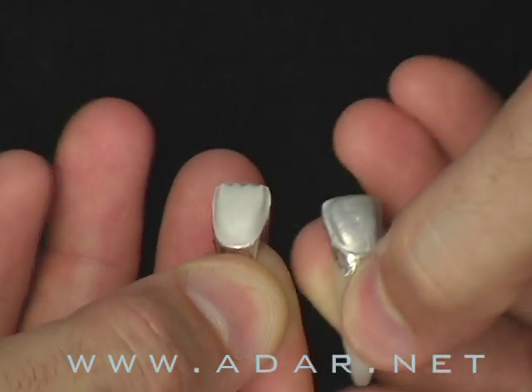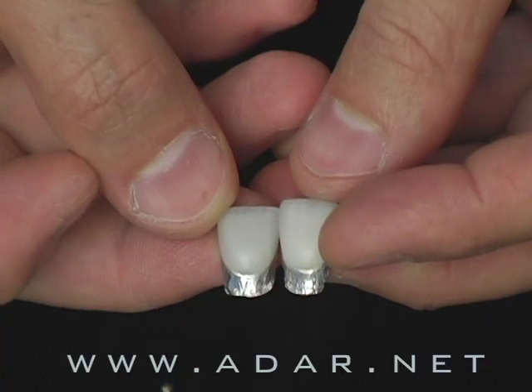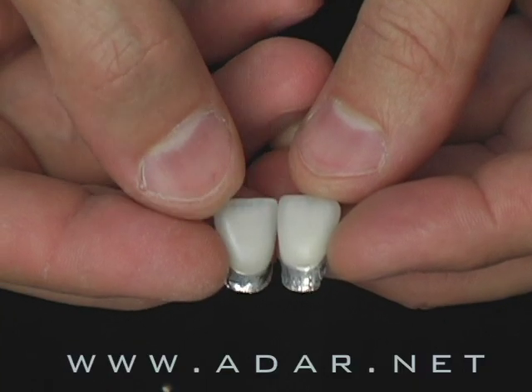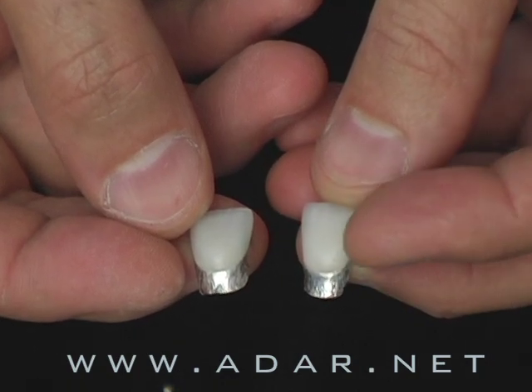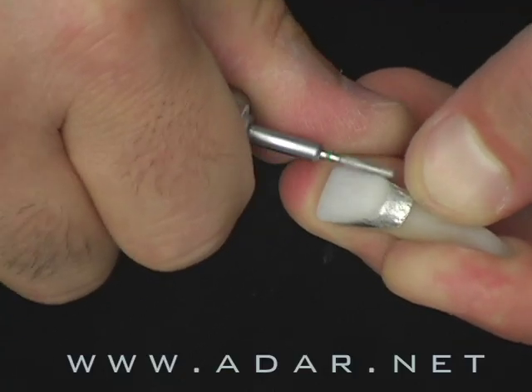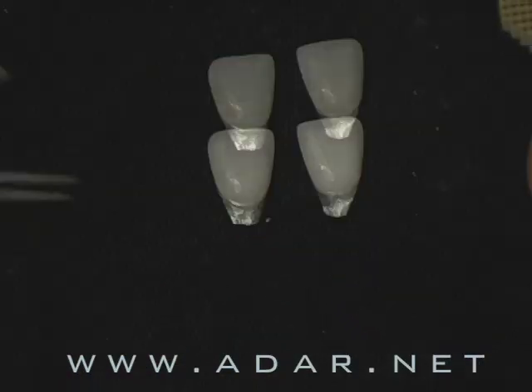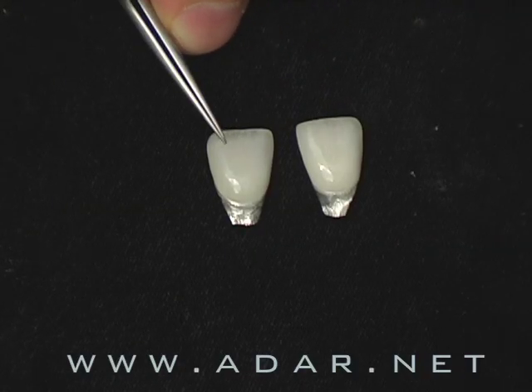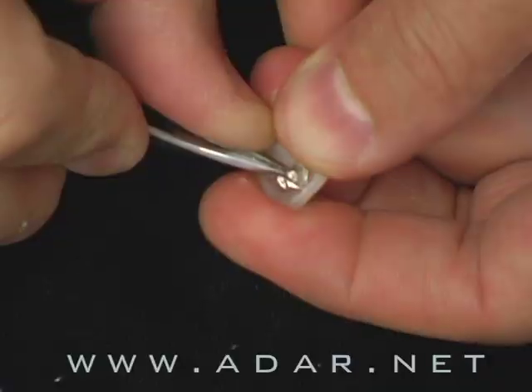Master your skill and master your communication skill with patients. This technique has saved me thousands of dollars through the years. I will teach you how to characterize, how to shape, how to texturize, how to finish the margin on a consistent basis. With foils you don't see the color, but after practicing 30 minutes a day you will learn how to do it and become a master — seeing the color even though there's a foil underneath the restoration.